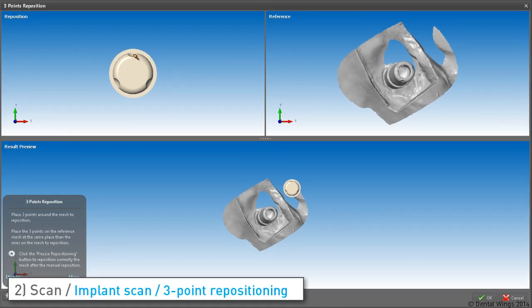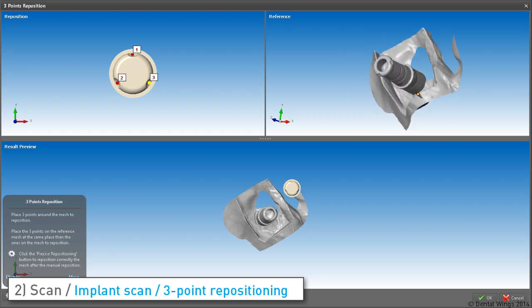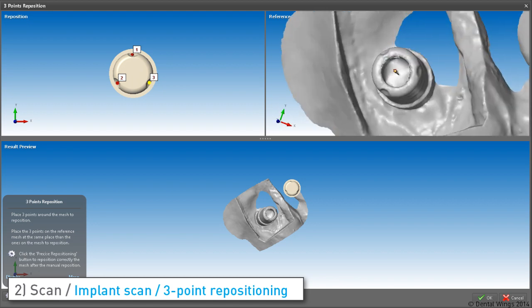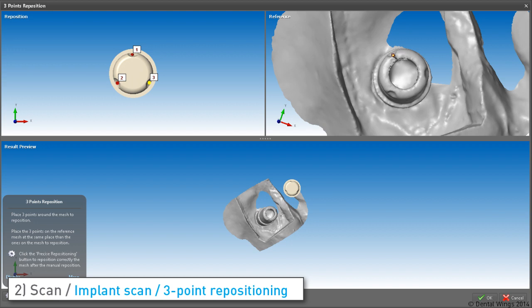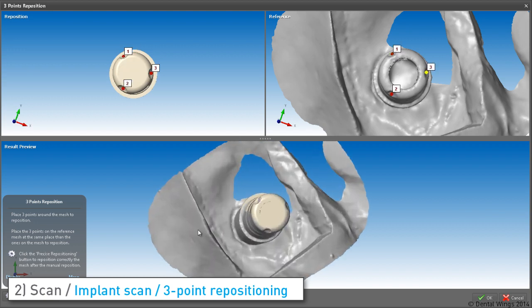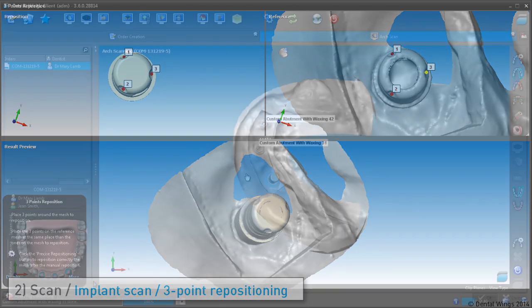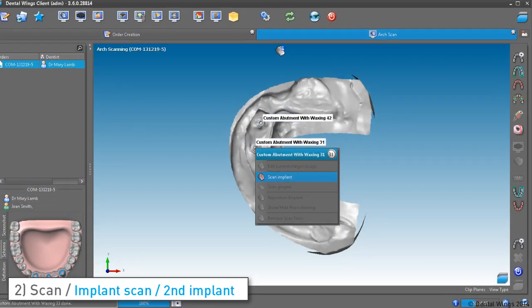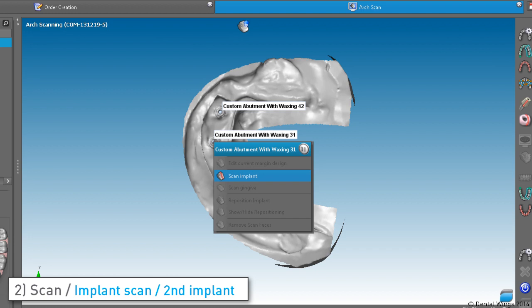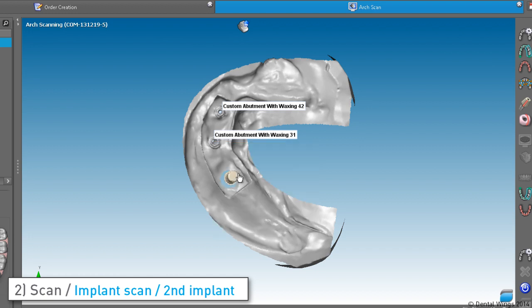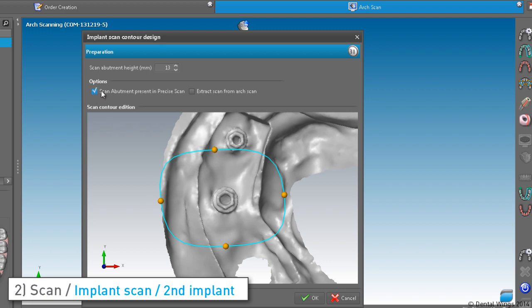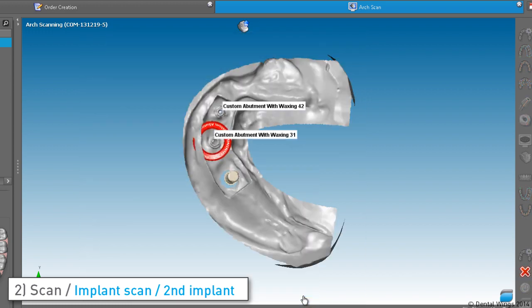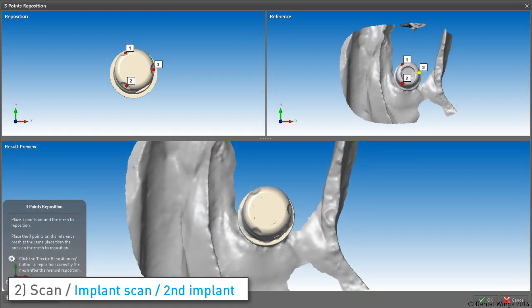Now match the virtual scan jig with the jig just scanned by performing the three-point repositioning. Right-click to initiate the second implant scan. For each implant, repeat the precise scan area, placing the scan jig on the model and performing the three-point repositioning.